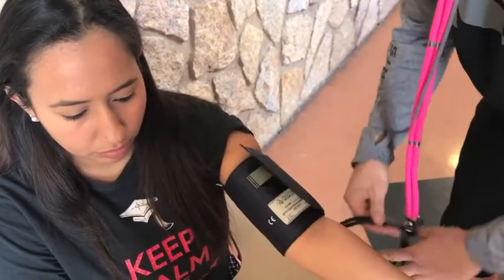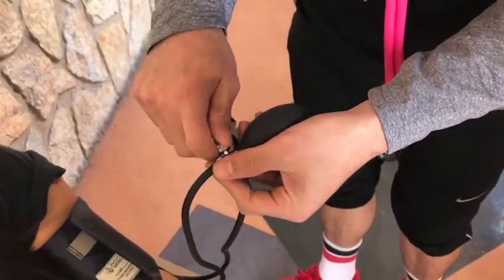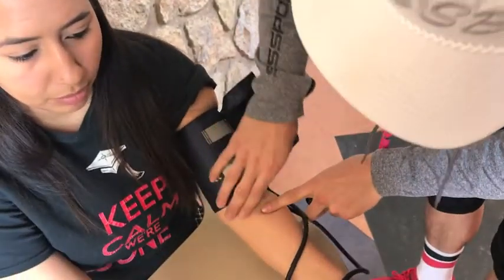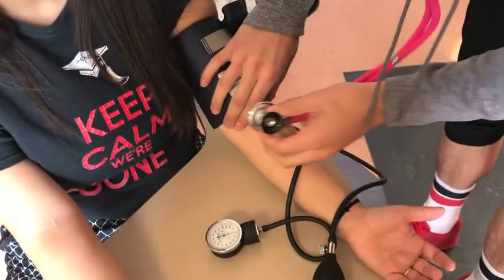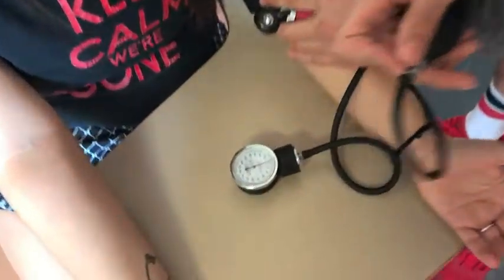Double check that the dial of the hand bulb is turned all the way to the right so that no air can be released from the bladder of the cuff. Next, palpate the medial side of the upper arm to locate the brachial artery and place the diaphragm of the stethoscope directly on top of it.